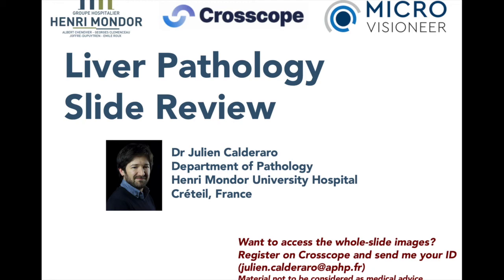So welcome to case number 2 of the liver pathology slide review. It's an important case. Remember that you can access the whole slide images on Crosscope. You just have the info to get access at the bottom of this page.